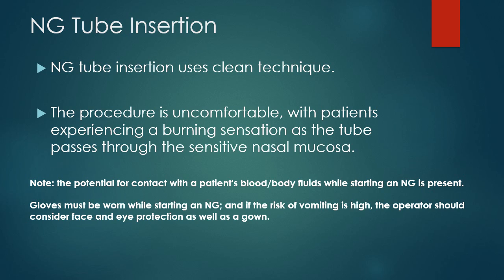Now, it is a nursing responsibility to insert an NG tube. However, it's only done with a doctor's order. In fact, you can't even remove the tube from one nostril and insert it to another nostril without a doctor's order. So you must have a doctor's order for an NG tube insertion.